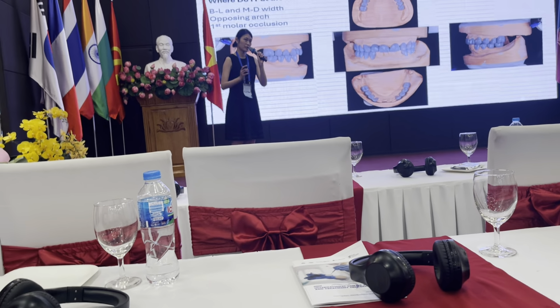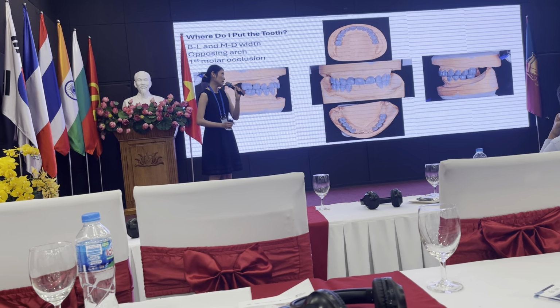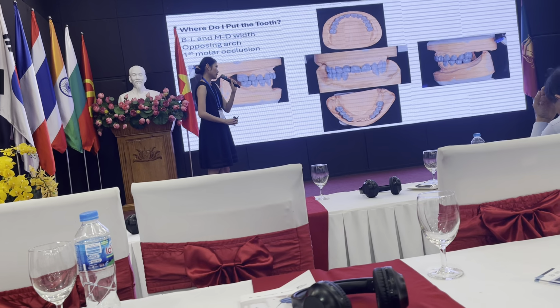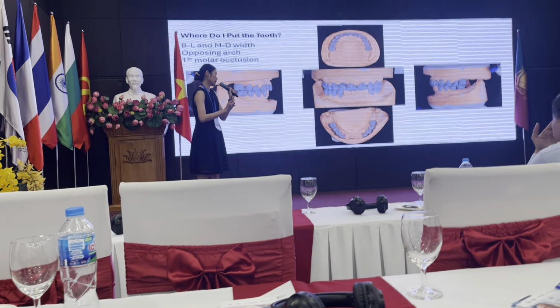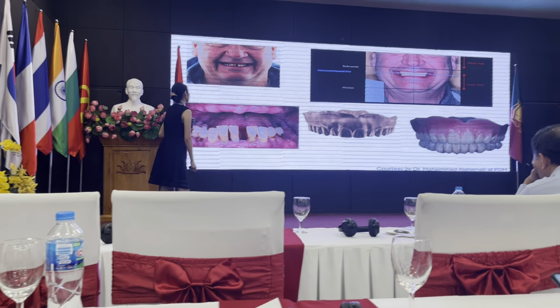So if you have a single tooth, that might be okay if the tooth space is bounded. But if you have multiple missing teeth, I recommend you make a diagnostic cast.